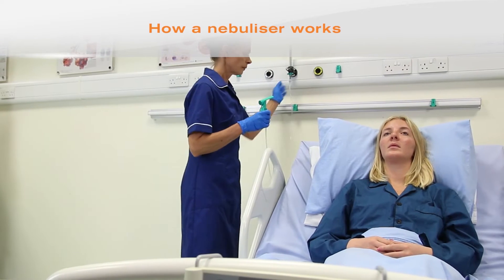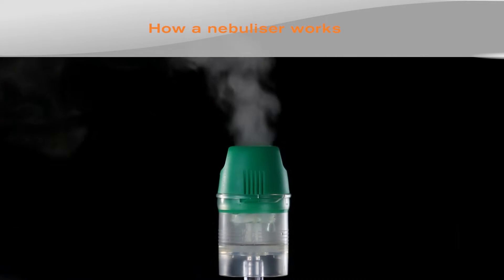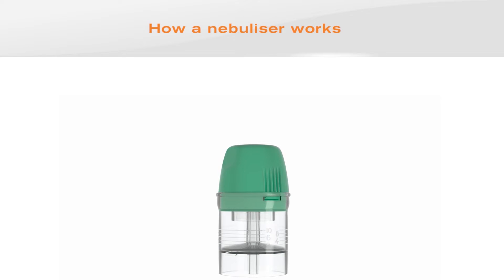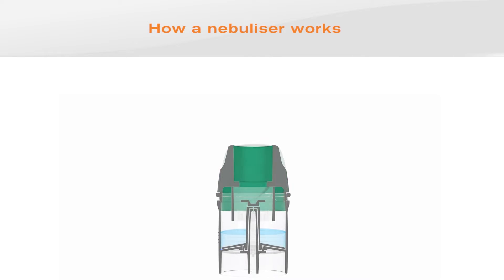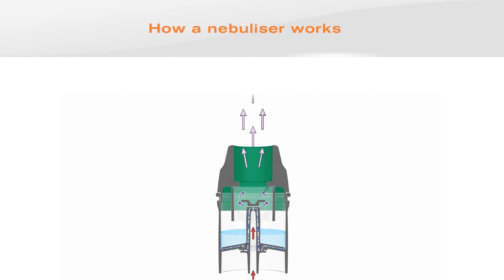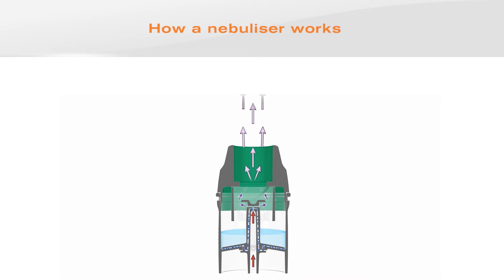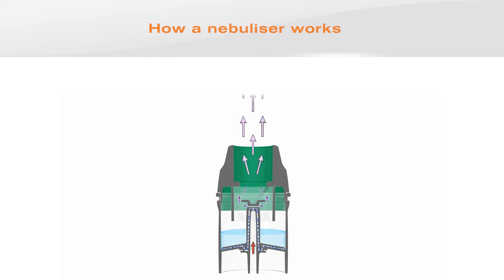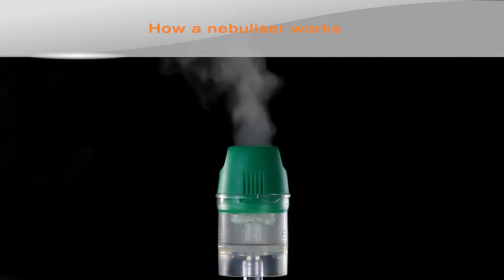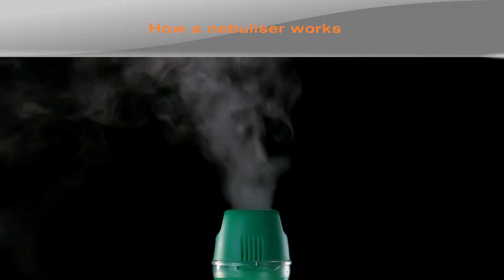The function of the tubing is to convey the compressed gas from source to the nebuliser. A nebuliser is a device that converts a liquid solution or suspension into aerosol droplets suitable for patient inhalation. The chamber is filled with a drug; gas flow is driven up a tube through the centre, creating low pressure which draws the drug to the top. The aerosol is then forced at high speed against a baffle, which recycles large particles back to the nebuliser cup.